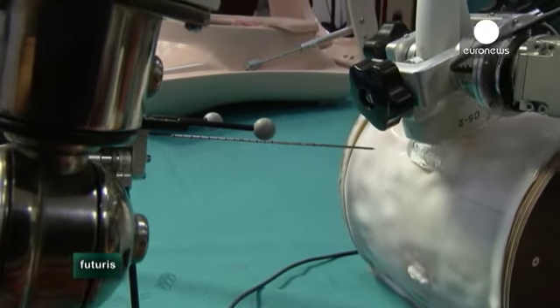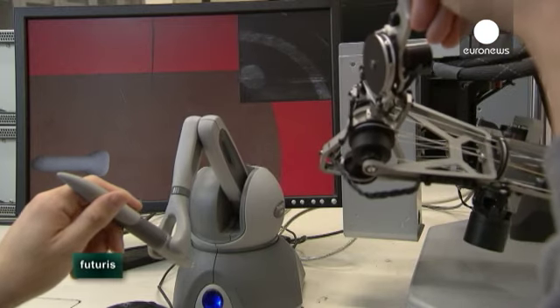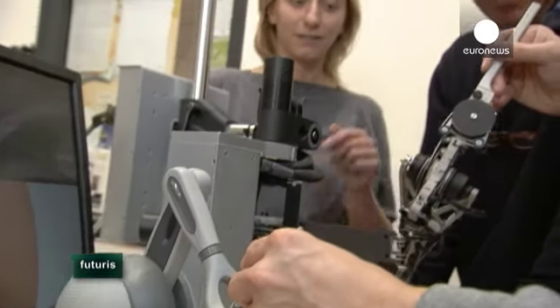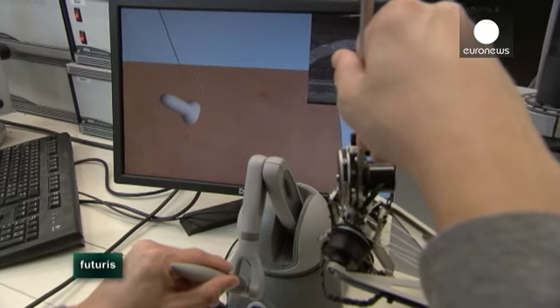We talked with surgeons to learn some of their techniques, but it is hard for them to accurately describe forces, speeds, the movements they perform during real surgery. So to solve this problem, we also developed computer simulators to help us get the data we needed. The simulator helped scientists to input realistic data to the robot to increase its understanding of different surgical scenarios and eventually to become more autonomous.